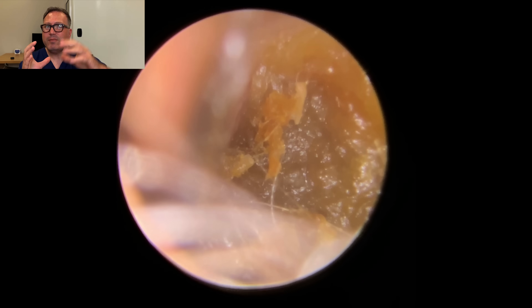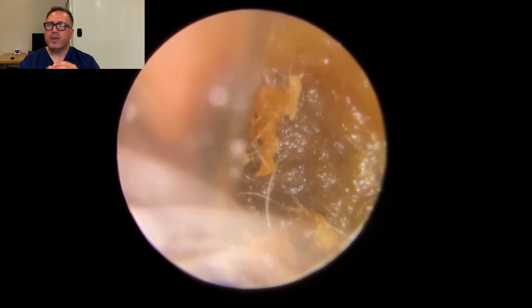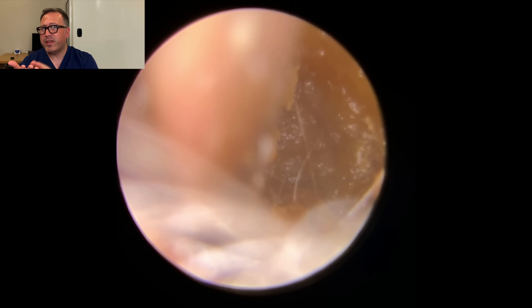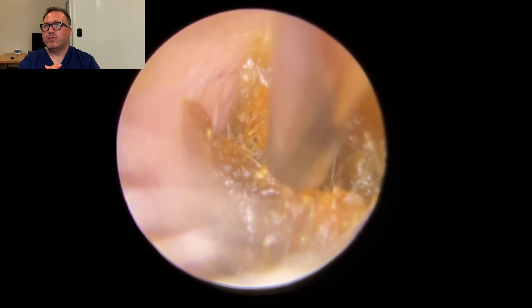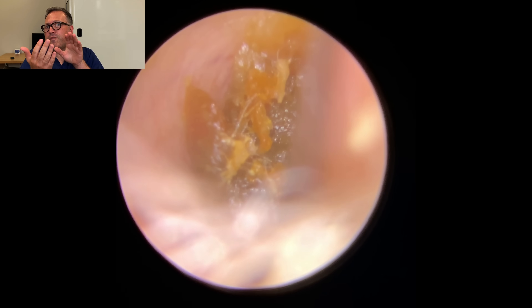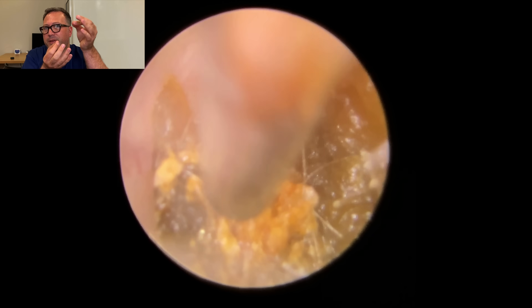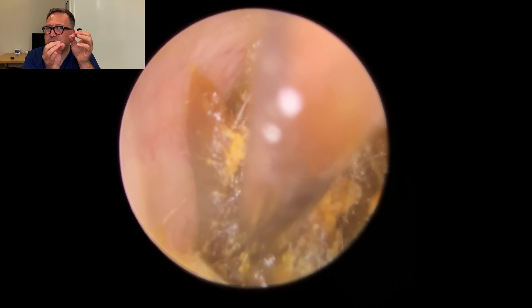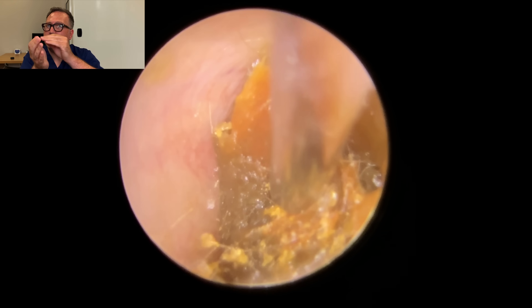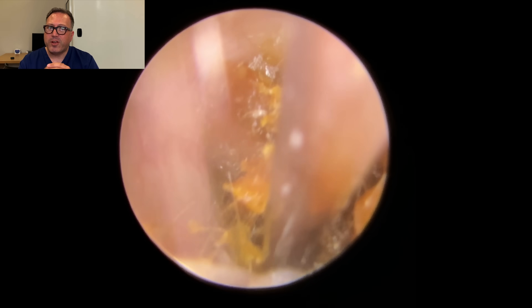Just keep trying to lift this base section away here, slowly working it off. Now remember the ear canals are extremely sensitive and very, very thin, so we've got to be really careful when working this close to the canal. The reason you can see those little fine hairs at the bottom of the view — if I push through those hairs it reduces the movement to the fine end. Don't forget you work in a very small space, so you have to be conscious of both tools all the time so they don't crisscross over one another, which would cause a jarring movement in the ear canal.